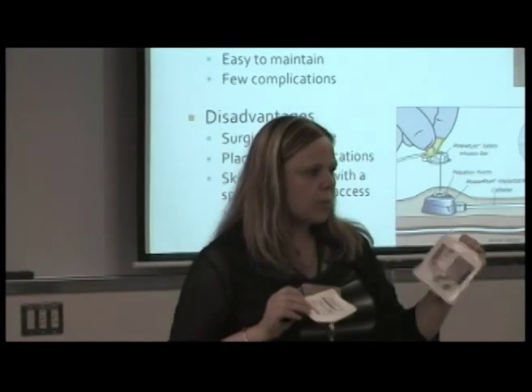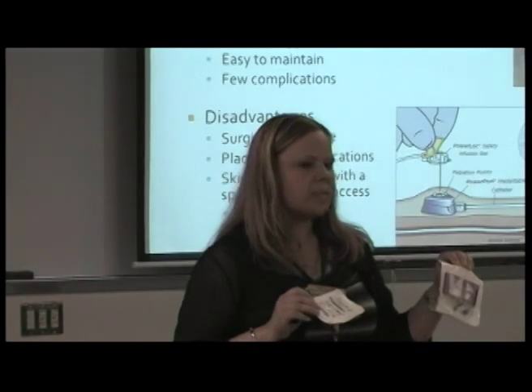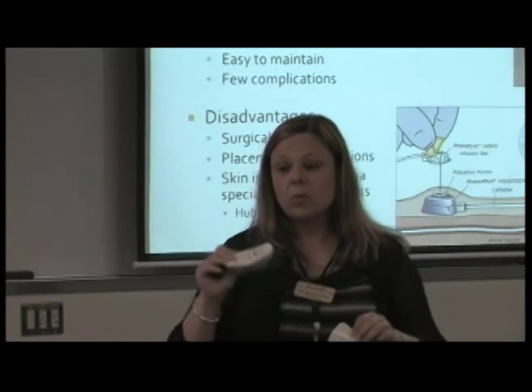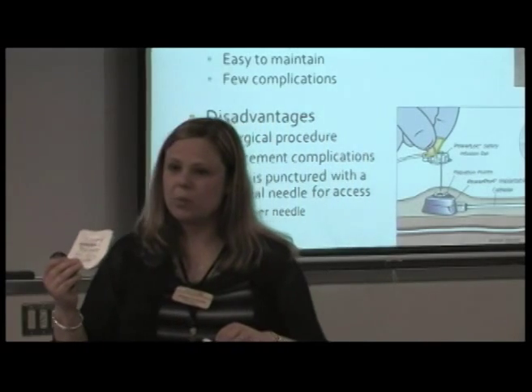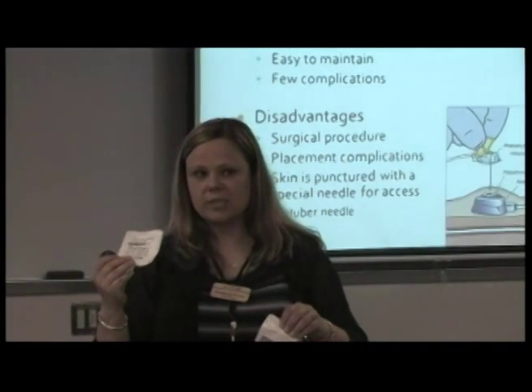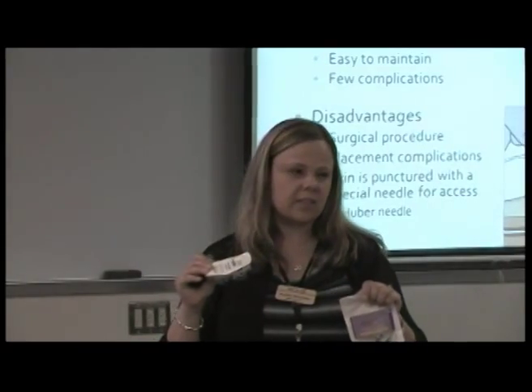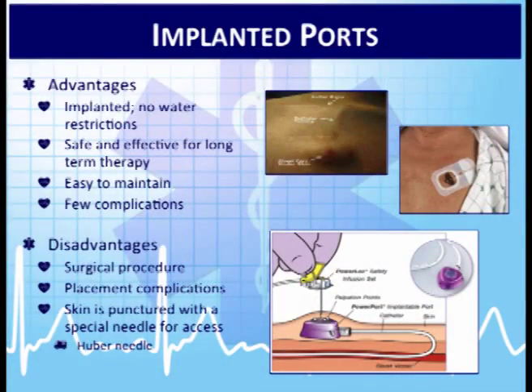So if that's something on the ambulance services that you guys are going to be doing, we have to have this equipment. The power ports that patients have placed are nice because they can go to CAT scan and have contrast injected through them, whereas some of the older ports don't have that ability. The contrast is given under pressure. And this shows you the reservoir underneath the skin there. In the middle of that area on the med port, kind of a soft spot, that's where we would want our catheter to go in.